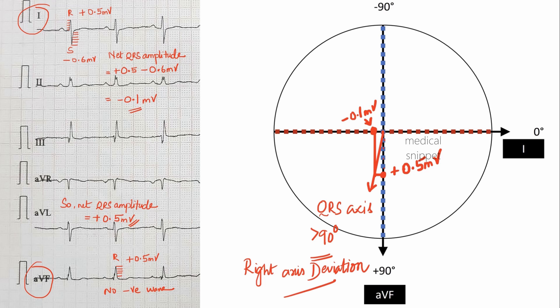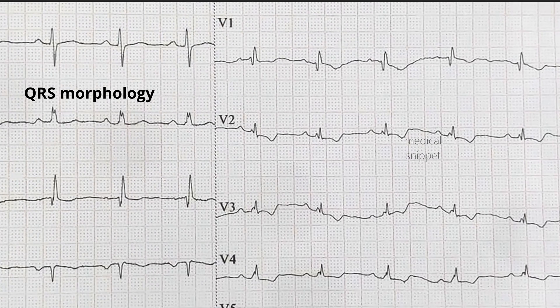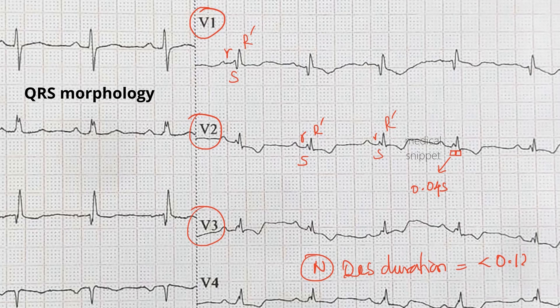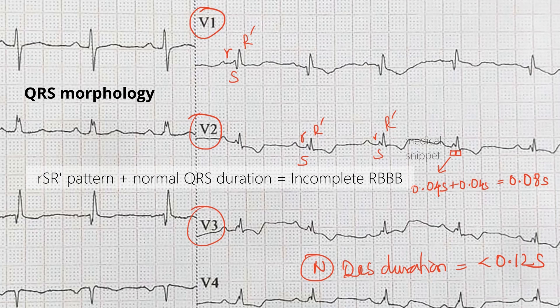Next we will check the QRS morphology in leads V1 to V3. In lead V2 there is an RSR pattern, but the QRS duration is normal, that is within three small boxes. One small box is 0.04 seconds, that is less than 0.12 seconds. In this ECG the QRS duration is 0.08 seconds, as it occupies only two small boxes. RSR pattern with normal QRS duration is called incomplete right bundle branch block.